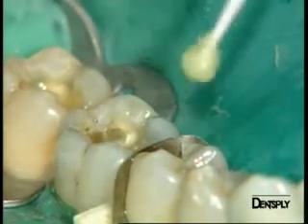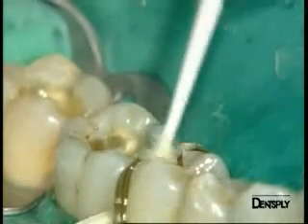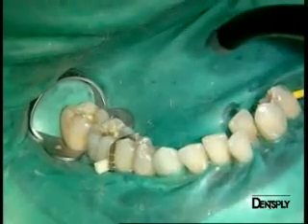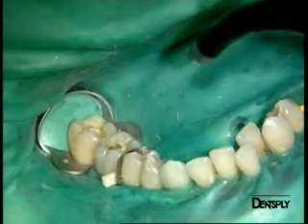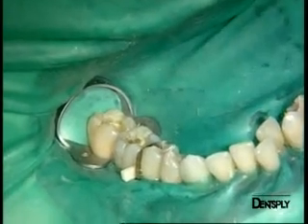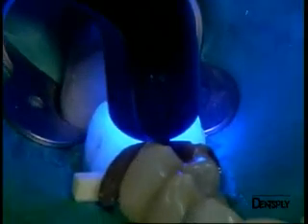With the premolar, make sure that you treat the entire dentine surface, especially under the enamel undercut. The solvent is then spread using a gentle stream of air — hold far enough away to avoid thinning the adhesive layer by excessive air drying. Each cavity is then light cured; ten seconds for each cavity is enough to polymerize the adhesive. Curing is important to achieve a good, deep polymerization of the hybrid layer within the dentine.